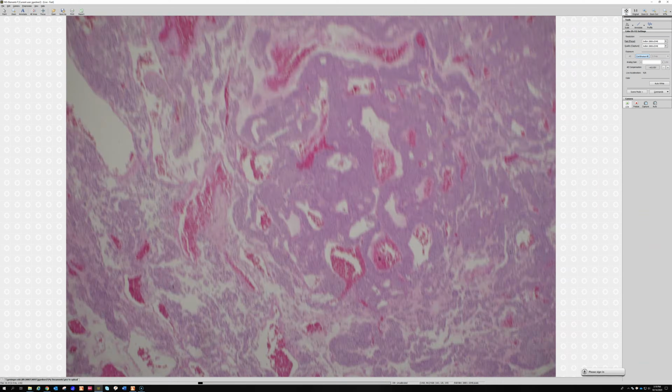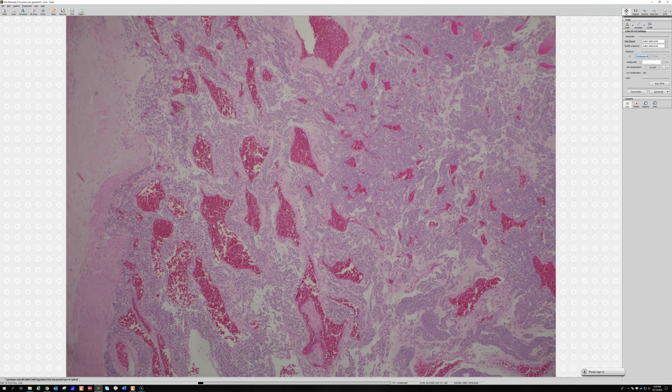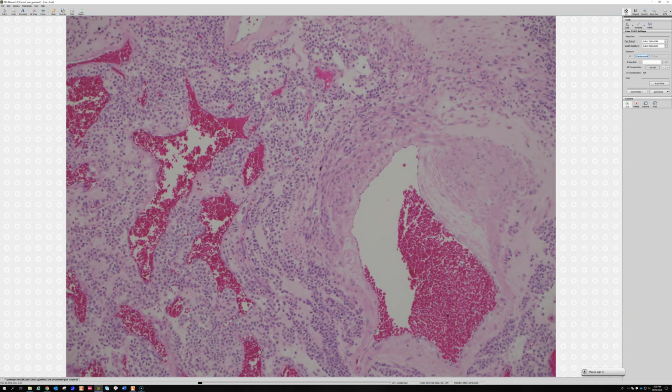And, you know, in the skin and soft tissue, if we see a really big or deep glomus, we get worried that it might be an actual malignant glomus. But in the stomach, the rules that we use elsewhere for benign and malignant don't seem to apply the same way. This is still an area that's not fully fleshed out, but I remember Chris Fletcher gave a course once, and he was talking about that if I recall, and I hope I'm not misquoting him, I'm sure someone will point it out if I am, but he said that the majority of these seem to behave indolently, even though they're large and deep. In the periphery, like in the leg or the arm, we would worry about a big, deep glomus, but in the stomach, it doesn't seem that they act badly. So anyway, really, really nice example of a gastric glomus tumor.